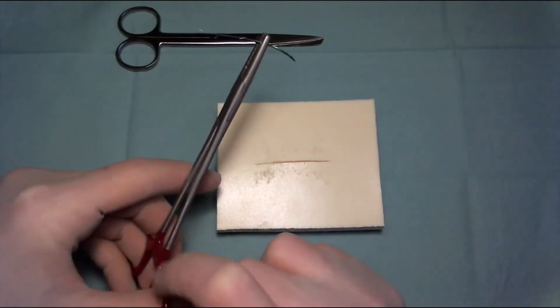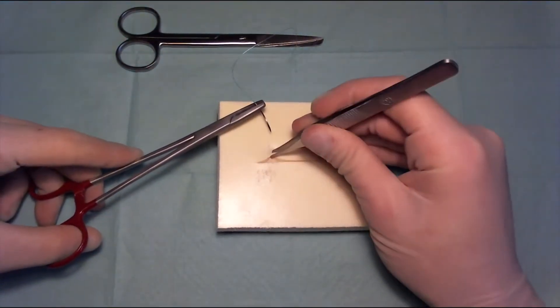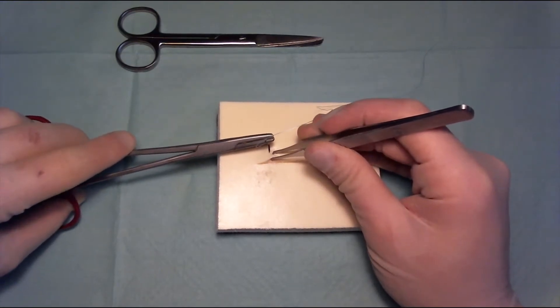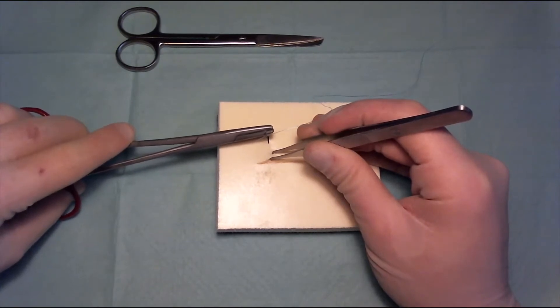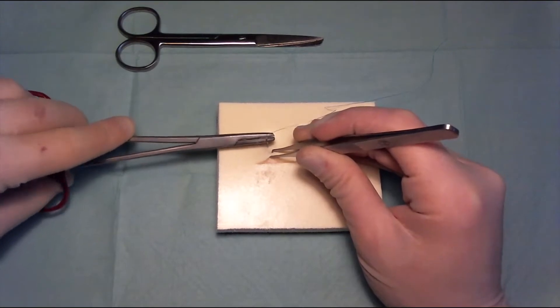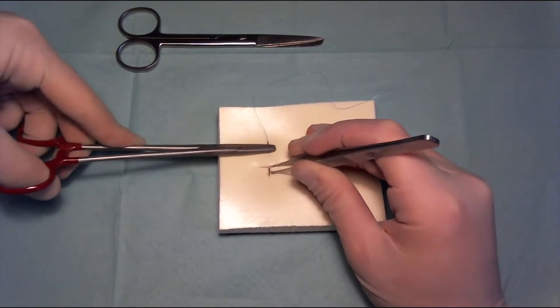We're going to start by everting the skin as well, but instead of starting at about half a centimeter, we're going to start a little bit further away from the wound edge. So we're going to go in here, put it through, and come out over here.